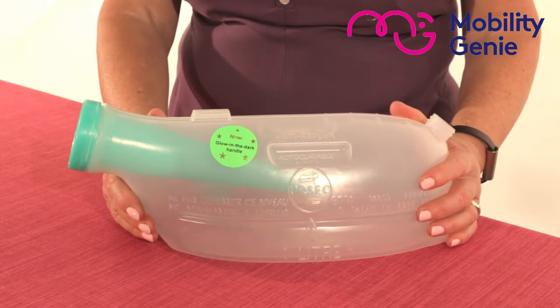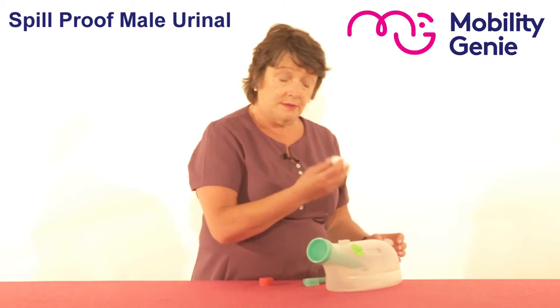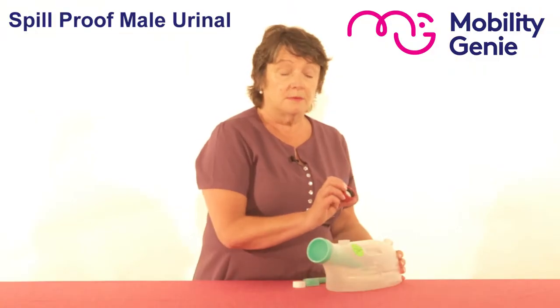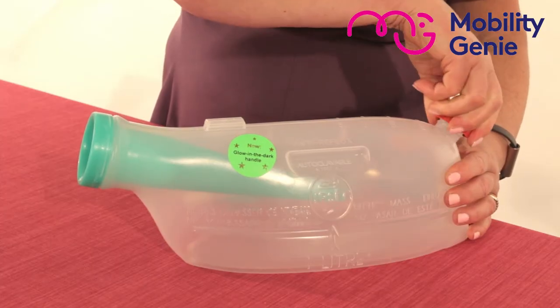It can be emptied using the hole at the back, using one of two screw caps. One is a normal screw cap and the other is a child-proof screw cap, like the one you'd get on your detergent bottle. You have to squeeze on that when you're opening it to make it easy for yourself.